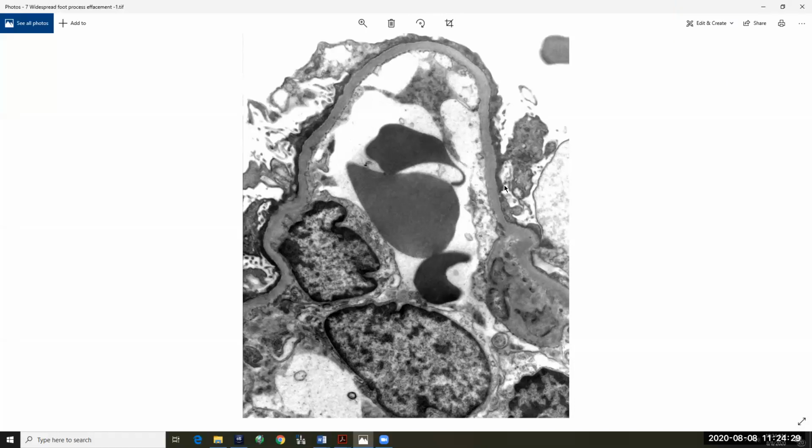Quick question about this. This is an EM, a very close-up view. And in the glomeruli, some of the gloms look normal, and then some don't. Do you have this podocytopathy typically happening all over, but you only see the segmental lesions in certain areas? Can you comment on that? Sure. So yeah, definitely. Basically, you are asking me a question. Are the podocytes getting damaged throughout the kidney, like all the million gloms are involved, or only a few, like on the light microscopy, we saw only 1 or 2 gloms getting damaged?